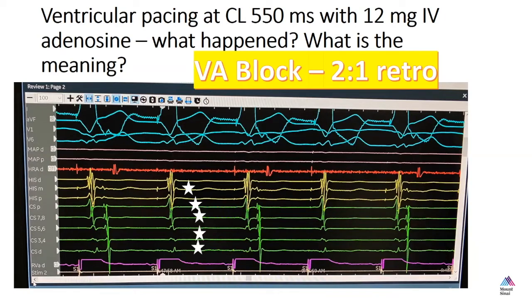So if you had a patient who is not pre-excited and had this observed finding with V pacing and adenosine, what is the most likely etiology for their SVT? Let's assume they had documented SVT. And let's say even that it stopped with adenosine clinically. I don't know. Is that AV nodal reentrant? Yeah. So that means that it's most likely that the patient has AV nodal reentrant tachycardia.